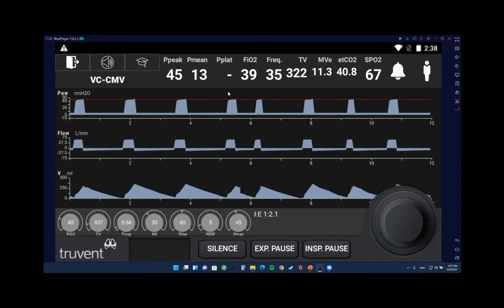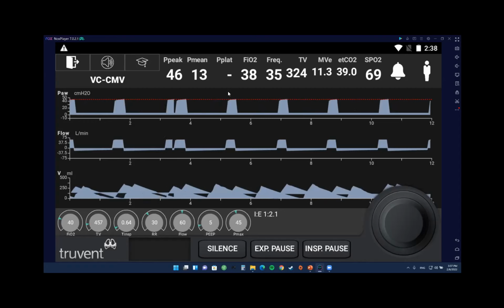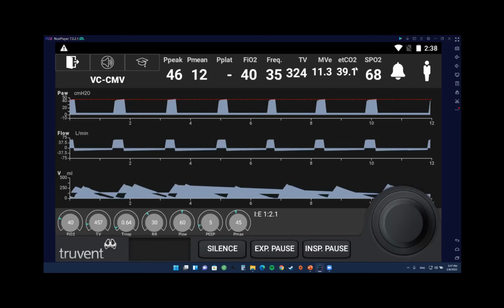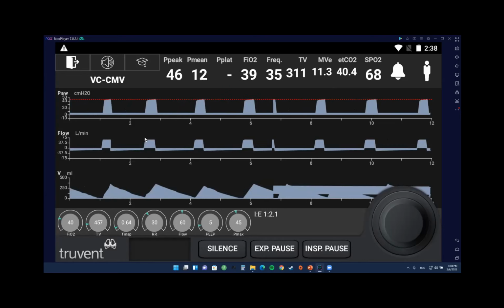I would assume is it the endotracheal tube? Well, it's going down the tube and it's stuck. So what else could be down there besides the endotracheal tube? In the meantime that we're talking, the SATs are dropping more. It's 70% now. Is there anything you want to do with the actual ventilator to give more oxygen to the patient?